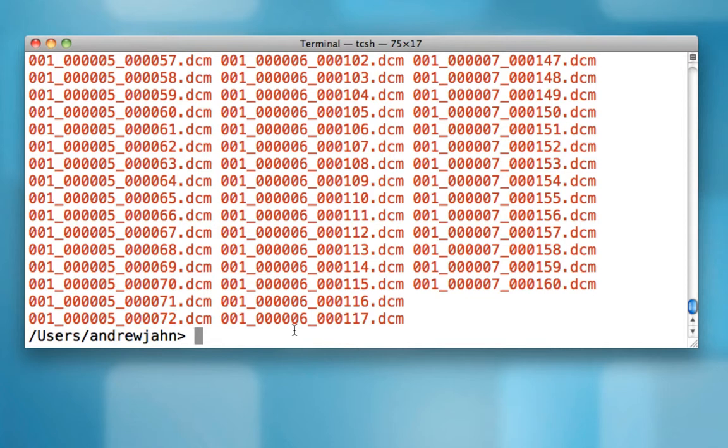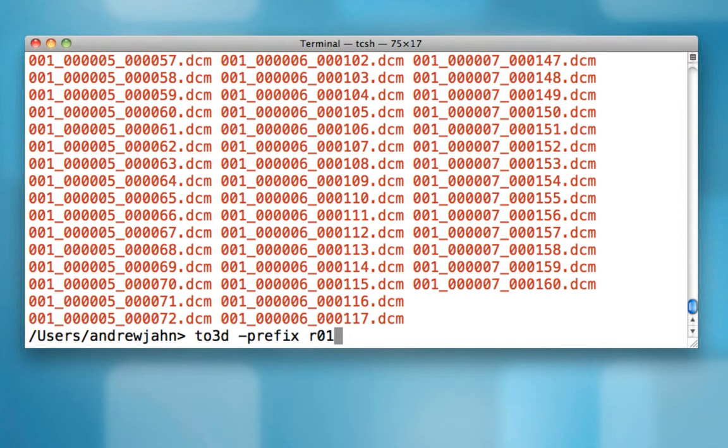So to convert run number five, we use to3d. This is similar to MRI Cron or SPM's DICOM import, if you've used those tools. And to3d needs a few different arguments. The first one is the prefix, or what do you want to call this output data set? For now, let's call it R01 for run one.